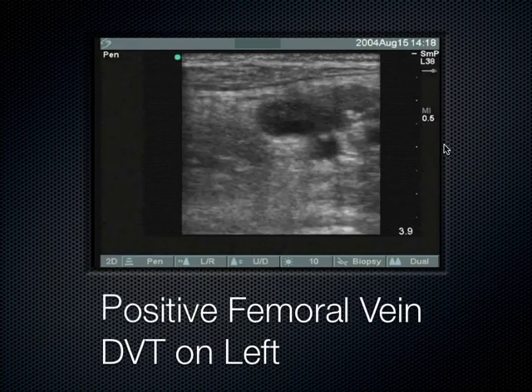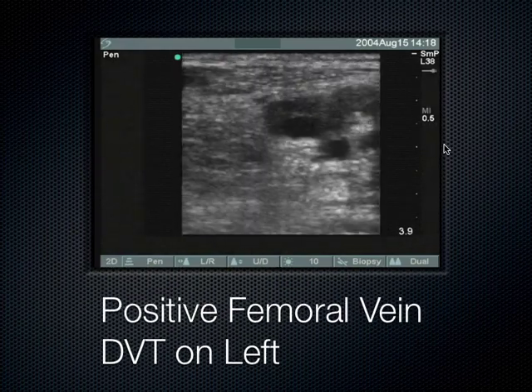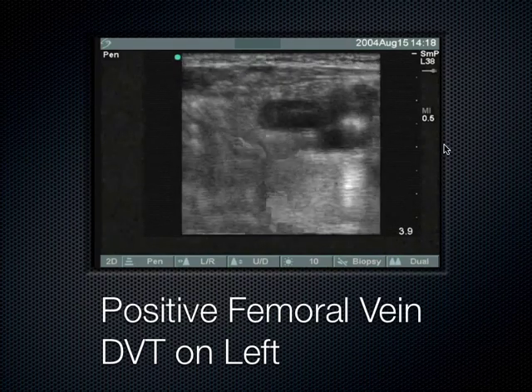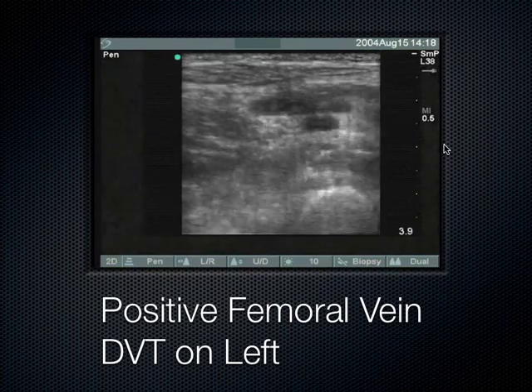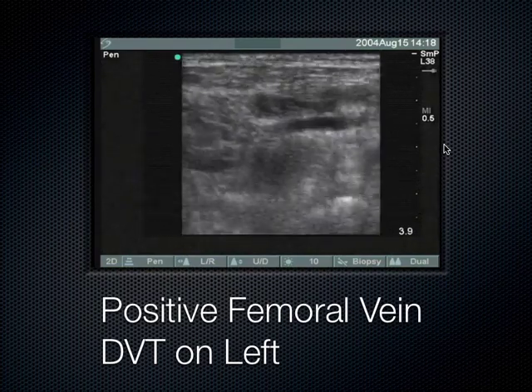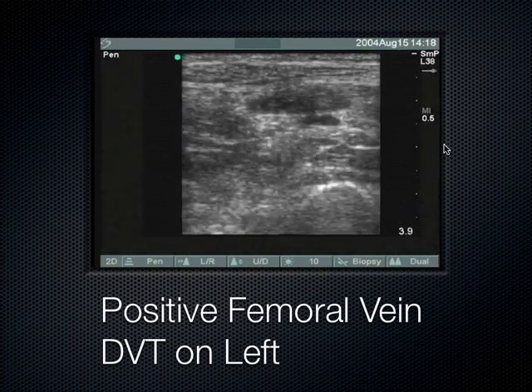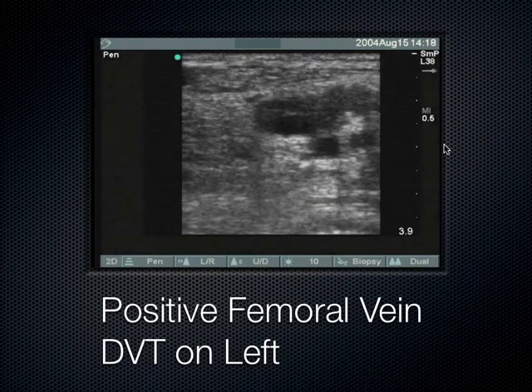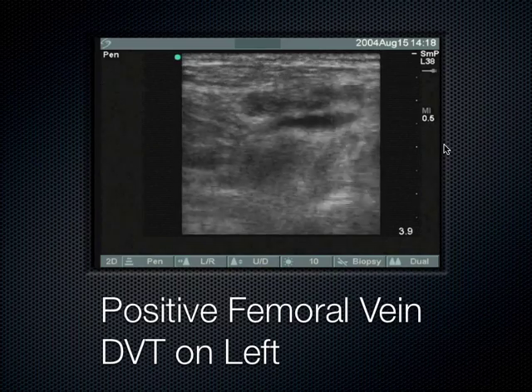And so when it's non-occlusive like that, it's partially occlusive. I mean, the blood's still going by. The patient's like, I don't know, my leg seems like it's kind of swelling. Those can still dislodge and go up and cause a PE, so it's still a very important thing, and you can see how you could miss it. And so this is a pitfall. We use that term pitfall in medicine to describe an area where you can get kind of hung up or in trouble. So keep in mind that that's a pitfall there when it's not totally occlusive yet.